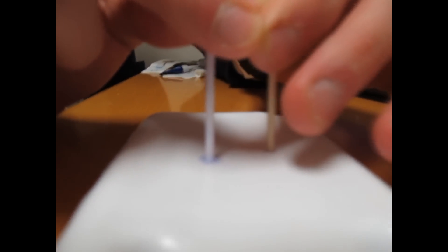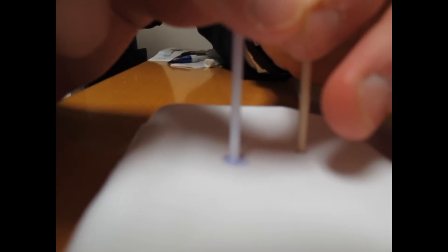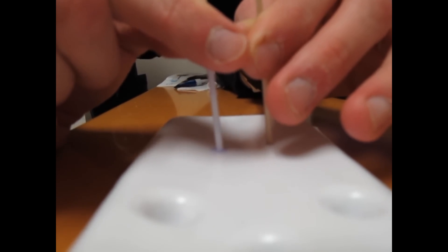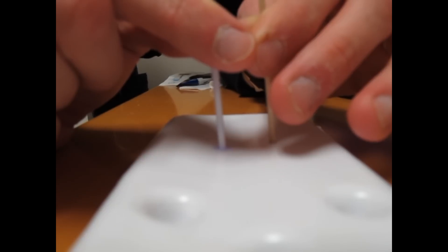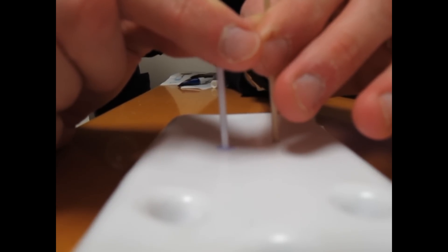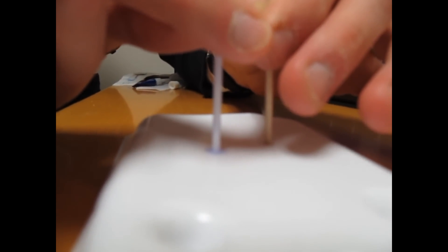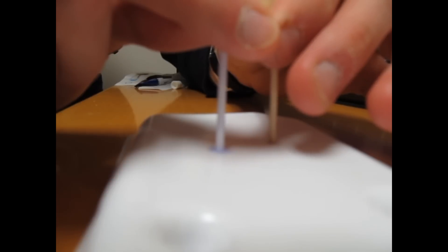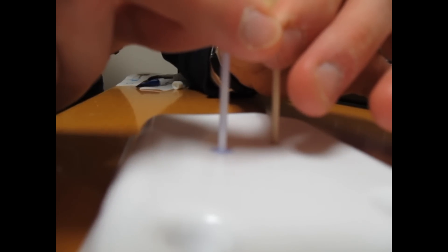If you look closely, with the plastic one you actually had more material come out — there's a larger ring around it. It actually soaked up into the tip, and there might still be some in there. That's an important consideration: if it fills up the hollow Q-tip, it would come pouring out and you'd have a Q-tip stuck to the kid's ear.